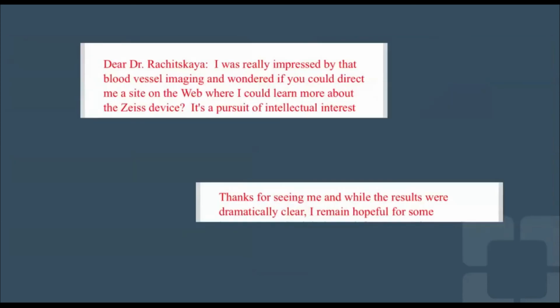So this is, I thought it was great because this patient, after I showed all of this, he sent me a message through the electronic medical system. And he said, I was really impressed by the blood vessel imaging. And in fact, he wanted to be directed to a website where he could learn more about the device. And I thought it was tremendous. And he said, it's in pursuit of intellectual interest. I want to learn more about it. I think this technology is awesome.